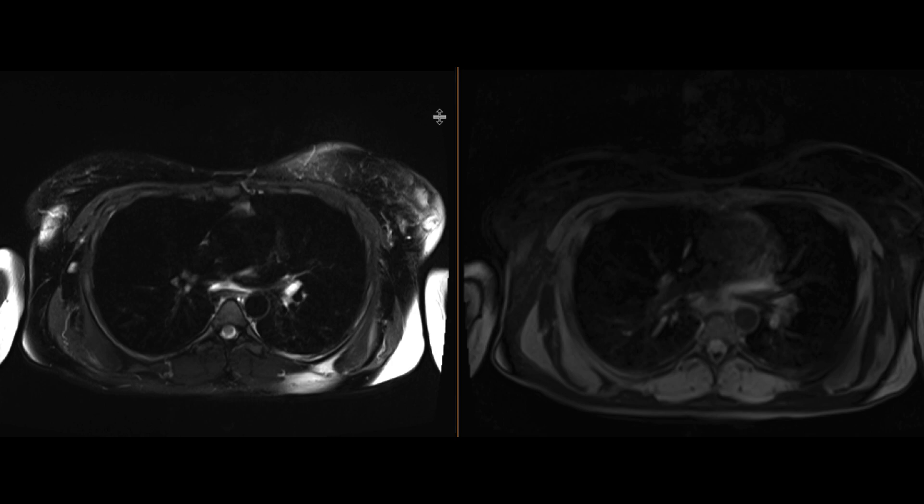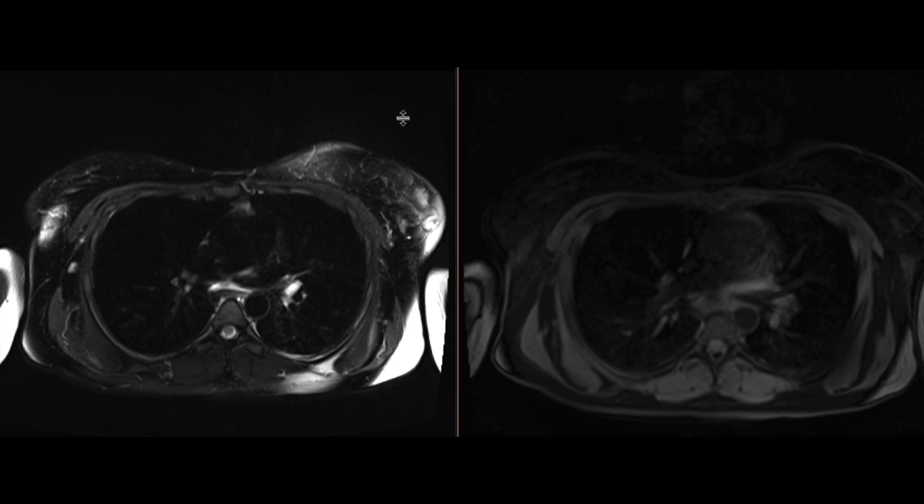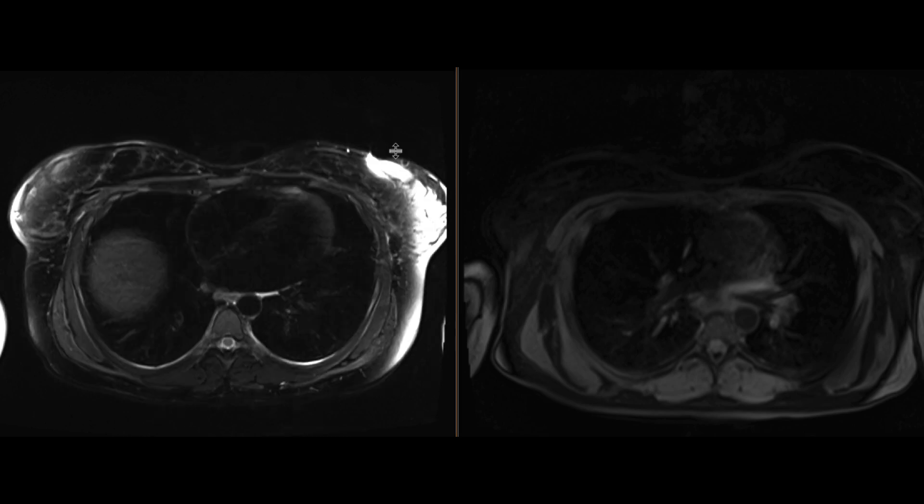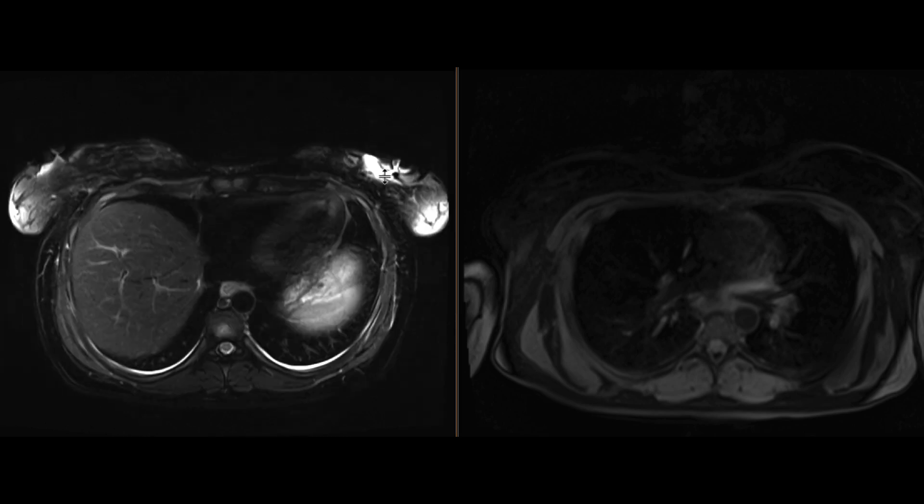This is a patient who had a liver mass discovered on ultrasound, for which an MRI was performed for characterization. We'll start off by looking at the T2 fat-saturated sequence.